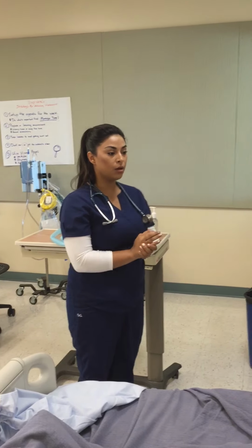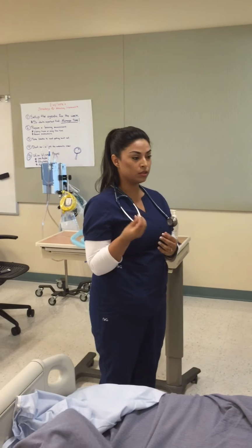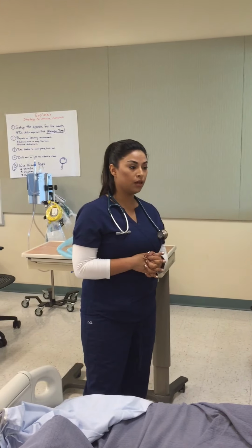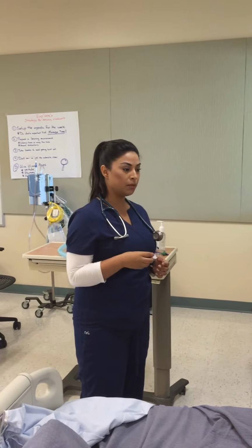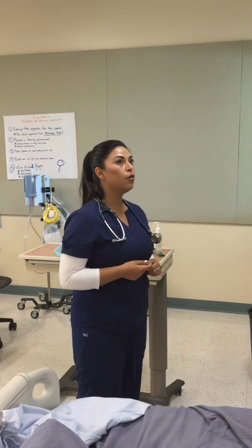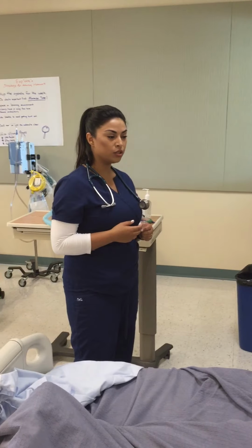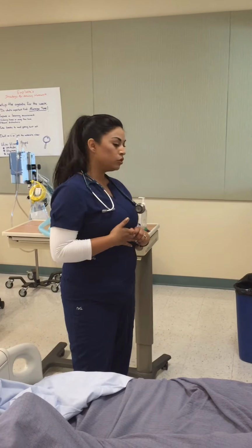It's going to relieve some of that swelling you're feeling and help mobilize some of those secretions that you have. We don't anticipate any complications, but some that could arise would be contamination, such as bacteria in the tubing, or you could feel overhydrated. So we'll make sure to help avoid any of those complications. Do you have any questions? And you understand the procedure? Okay, great. Before beginning, I'm also going to want to check your vitals.